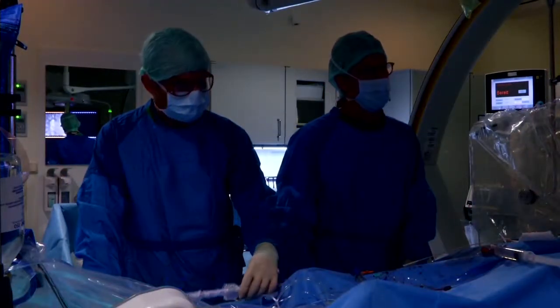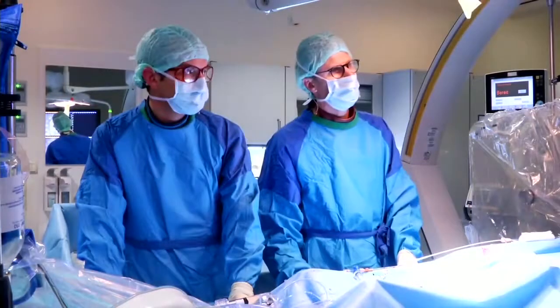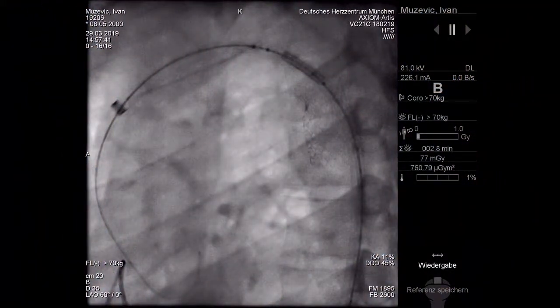Our plan is, have a look at this. So we have a long sheath in the ascending aorta, and we have a bib balloon and this 16 millimeter Max LD stent mounted. And I deliberately put it on the proximal end because I would like to avoid that the balloon is shifted to the ascending aorta by the rigid stent already in place. It's a little bit far proximally, but I think it will work. Perhaps I can push it a little bit higher up with a long sheath, but at the moment I'm quite fine with this.